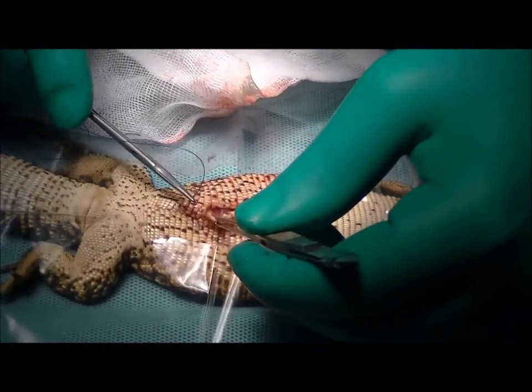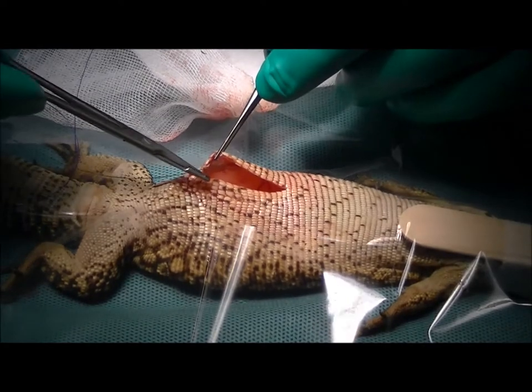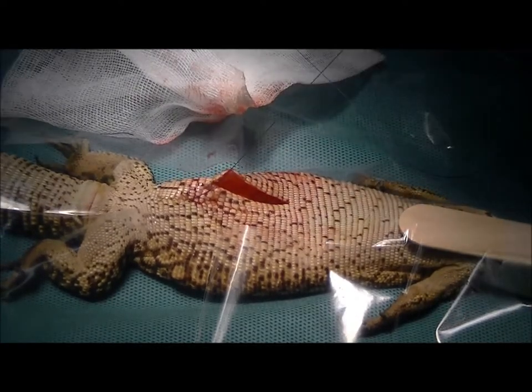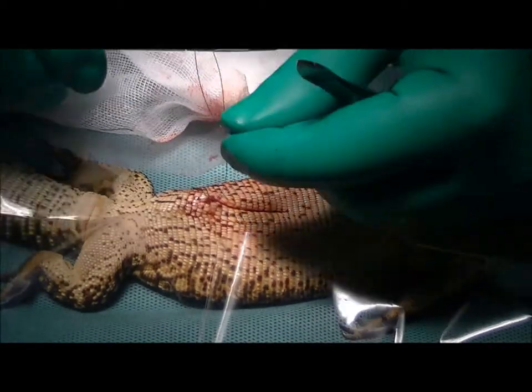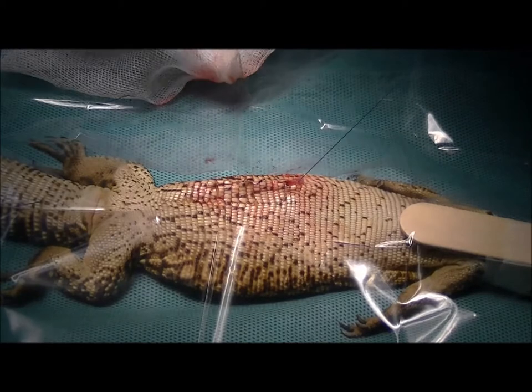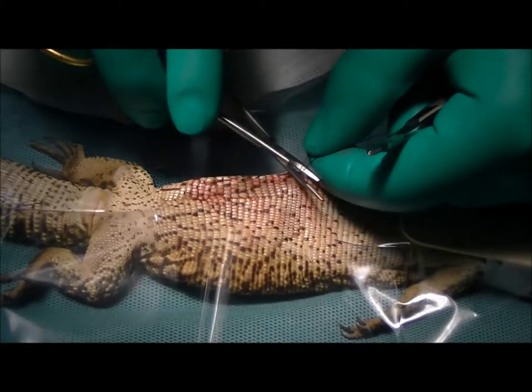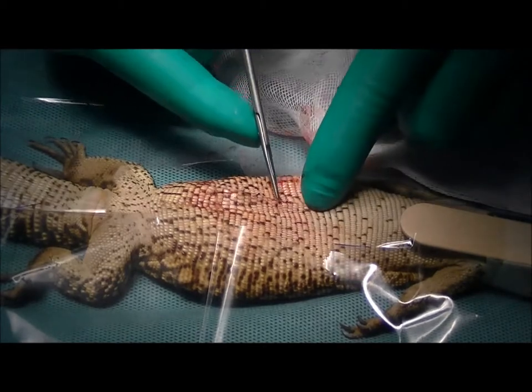To close, we're going to stitch the underlying muscle under the skin first, and then put a layer in the actual skin. We're using a dissolvable suture material called PDS. It's fairly fine work — these are only little animals, so lots of fine suture materials and little surgical instruments are needed. Putting the last suture in the abdominal wall now — we've closed up that body cavity. These sutures will dissolve over time, several months normally, so we don't need to take those out. They'll be buried underneath the skin.